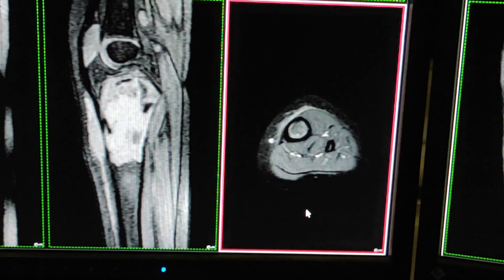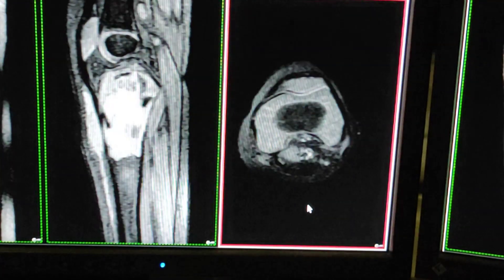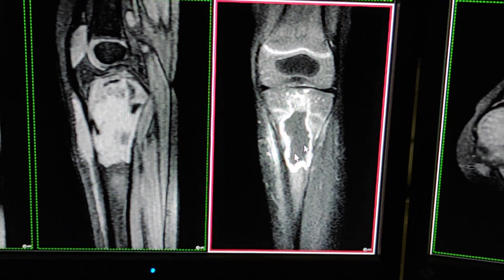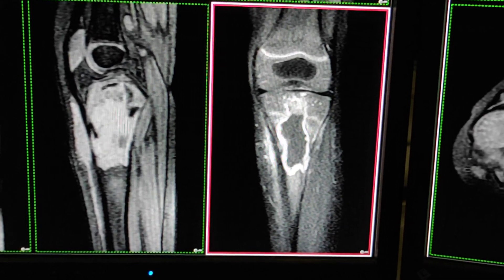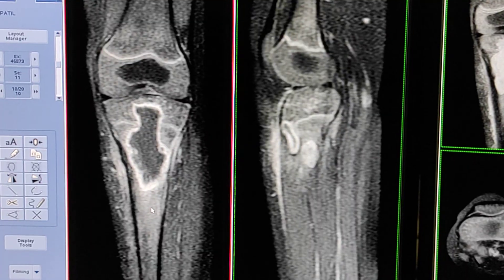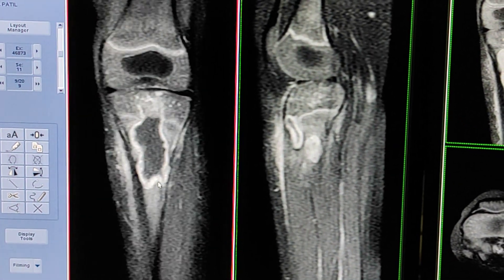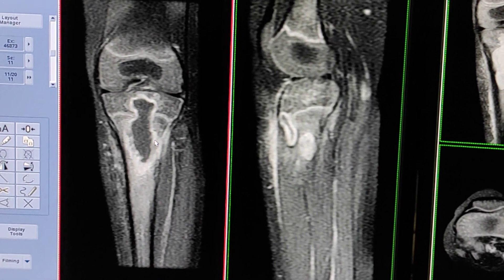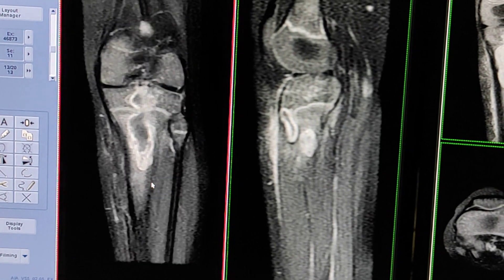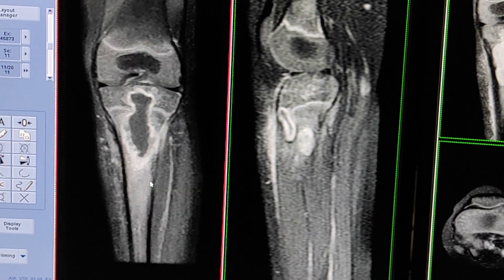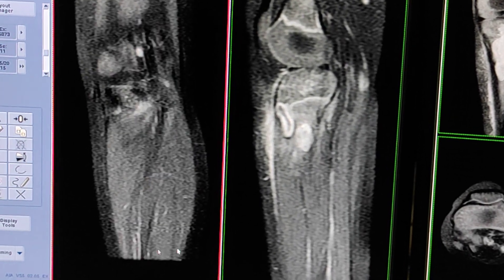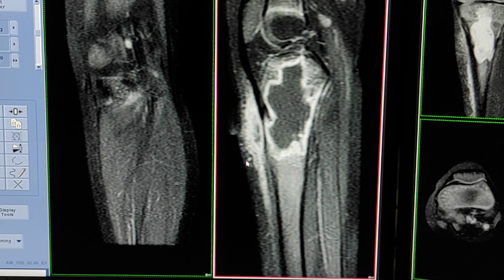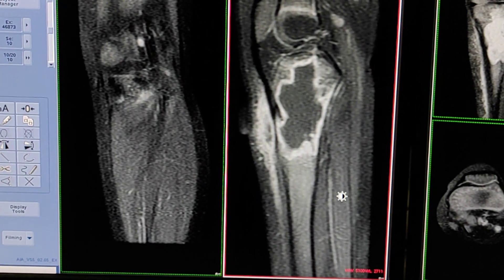This is the axial post-contrast T1 weighted image. Now I will show you the coronal T1 weighted sequence, followed by the coronal post-contrast T1 weighted — see the enhancement of the abscess. And now this is the post-contrast T1 weighted sagittal image — see the enhancement with gadolinium contrast.